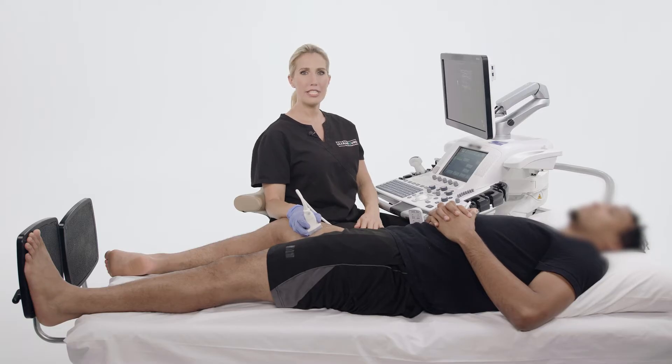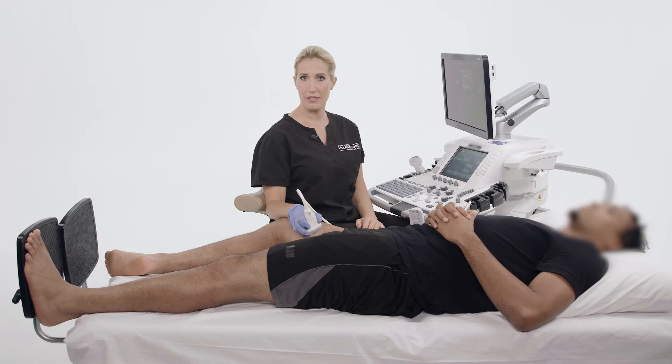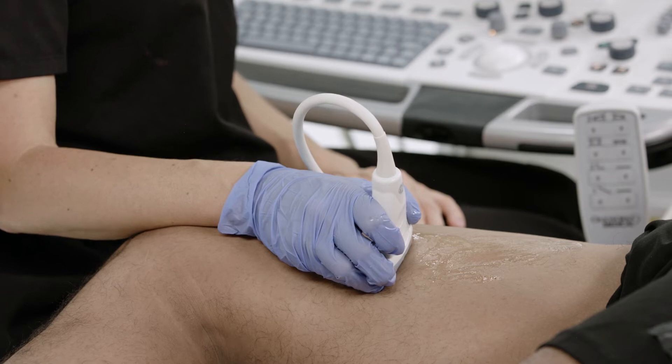Finally, we must consider the hand. Again, it should be aligned in a natural position. Many variations in grip are seen and just as many are recommended. Regardless of the grip you select, the most important aspect is to consider that you are holding the transducer lightly.